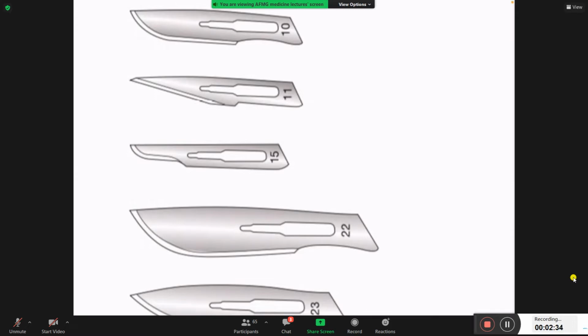Opening of an artery and then closing it back. So how will you open any artery? Artery is a hollow thing, so you use a stab knife. Similarly, you are told to do enterotomy, opening the intestine and then closing it back. So again, for intestinal opening, you have to enter with a stab knife.